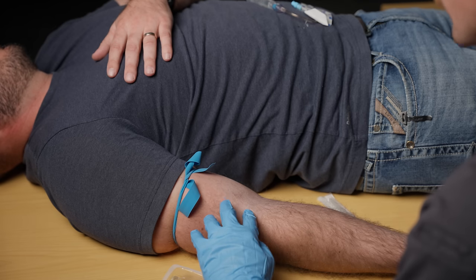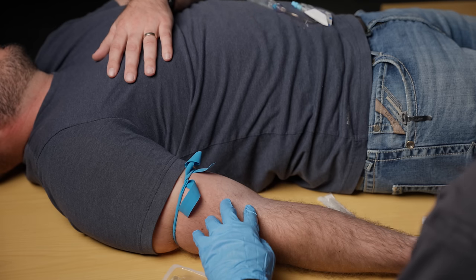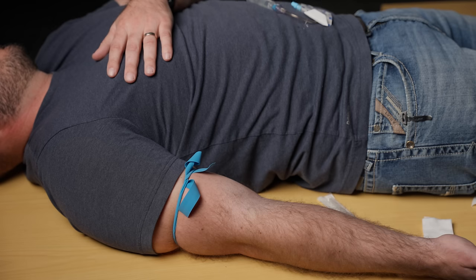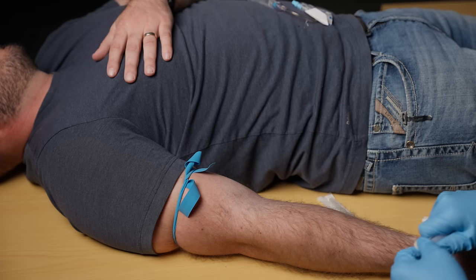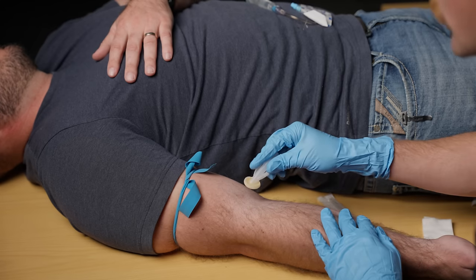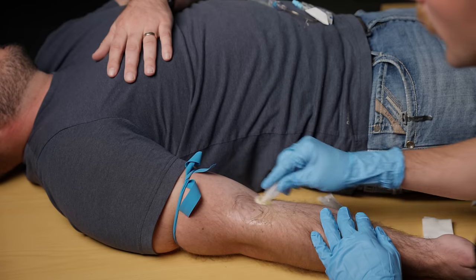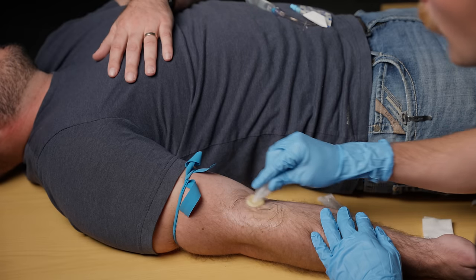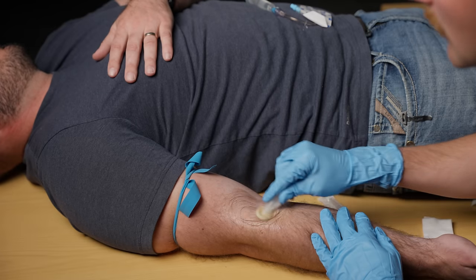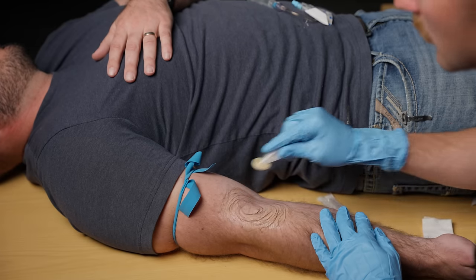Right here I've got one that I can feel on this side of his arm. I'm going to take my chlorhexidine — this isn't a sterile procedure but it is aseptic, which means I want to take this chlorhexidine, start in the middle of the site and work my way outwards. I want to do this for about 15 seconds and just get that nice and saturated with the chlorhexidine.